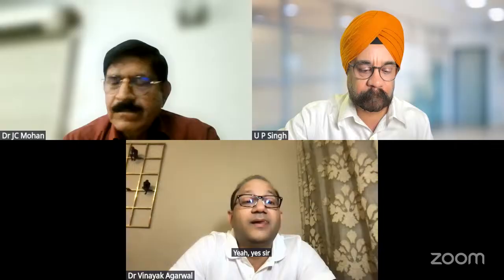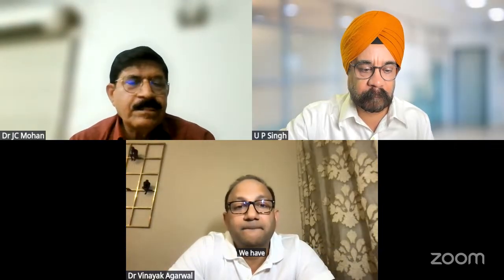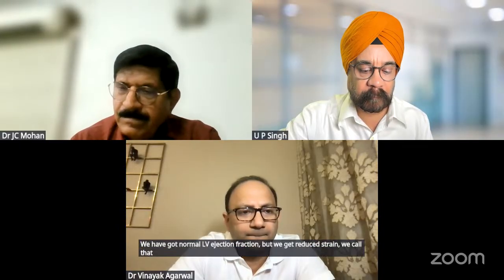Dr. Hamid, just... Yes, sir. I will corroborate your case with the LV dysfunction. We have got normal LV ejection fraction, but we get reduced strain. We call that subclinical LV dysfunction.